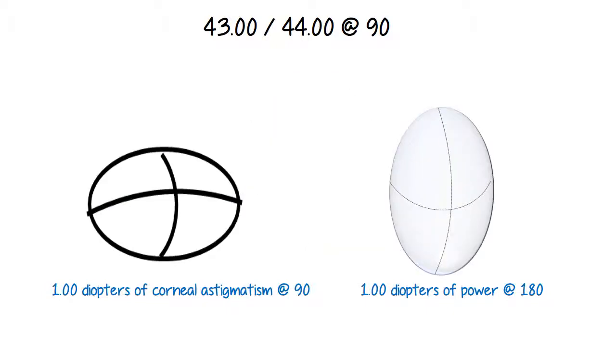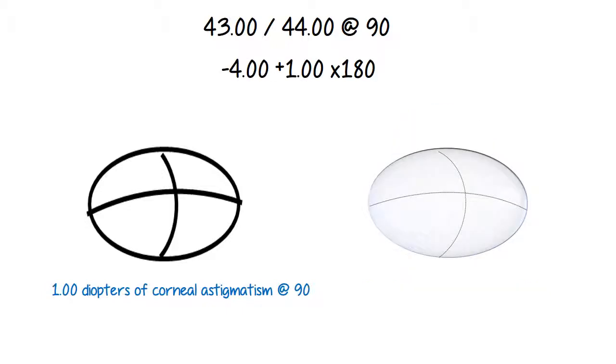But our refractometry tells us that we need a lens with an axis at 180. What gives? Now this is getting a little bit confusing because we're going back and forth between positive and negative cylinders, so we're going to draw a power cross. When in doubt, draw a power cross. That is, power crosses are the bridge between negative cylinder and positive cylinder.